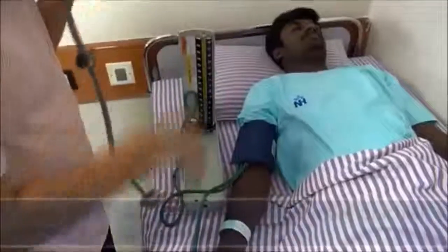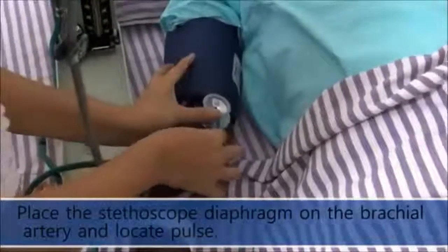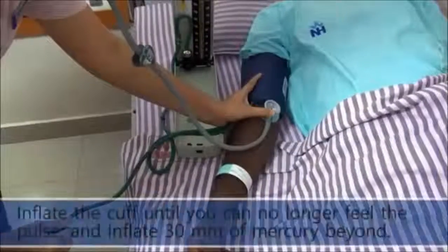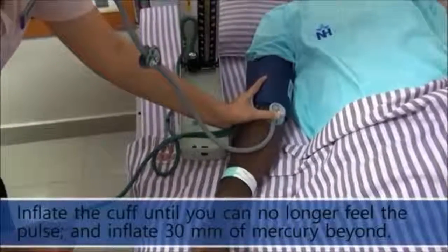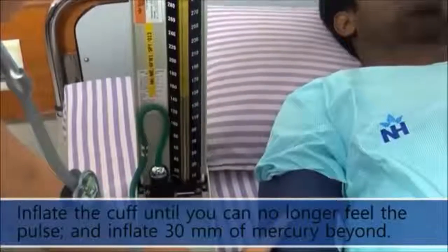Step 3. Measurement. Place the stethoscope diaphragm on the brachial artery and locate pulse. Inflate the cuff until you can no longer feel the pulse and inflate 30 mm of mercury beyond.